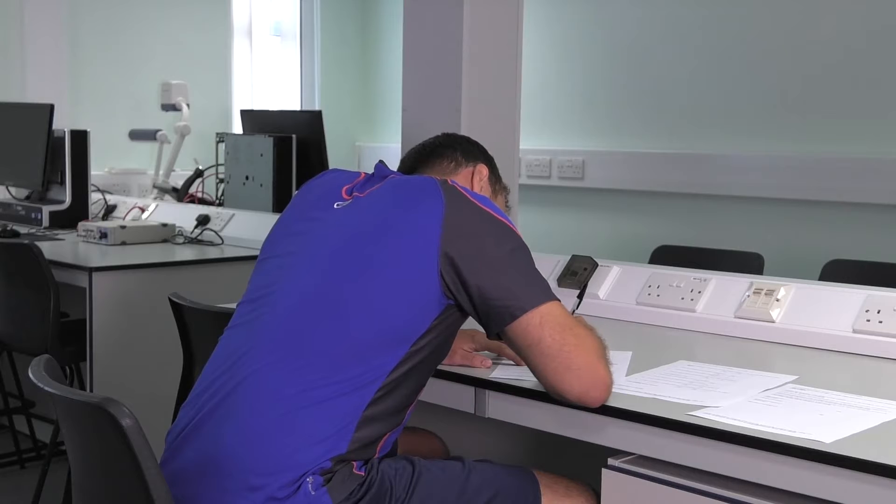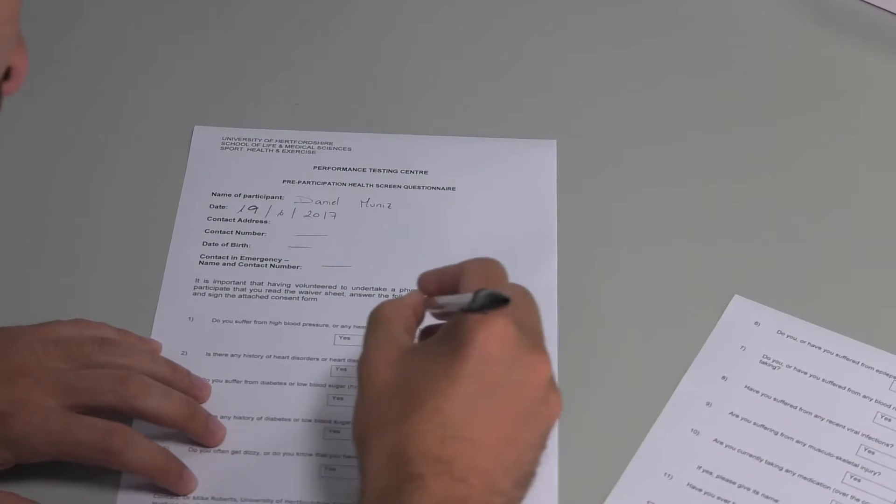This video is going to take you through conducting a lactate threshold test as well as a VO2max test.